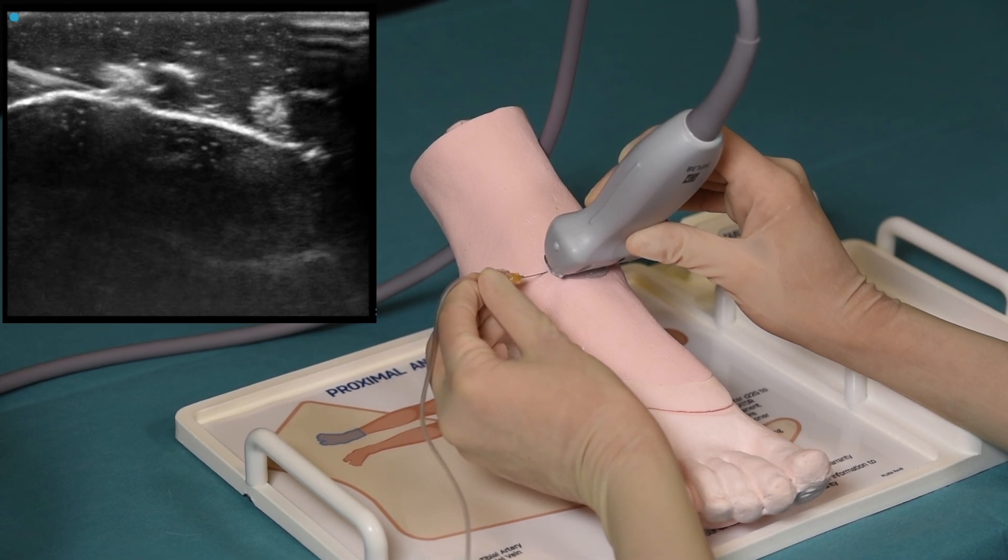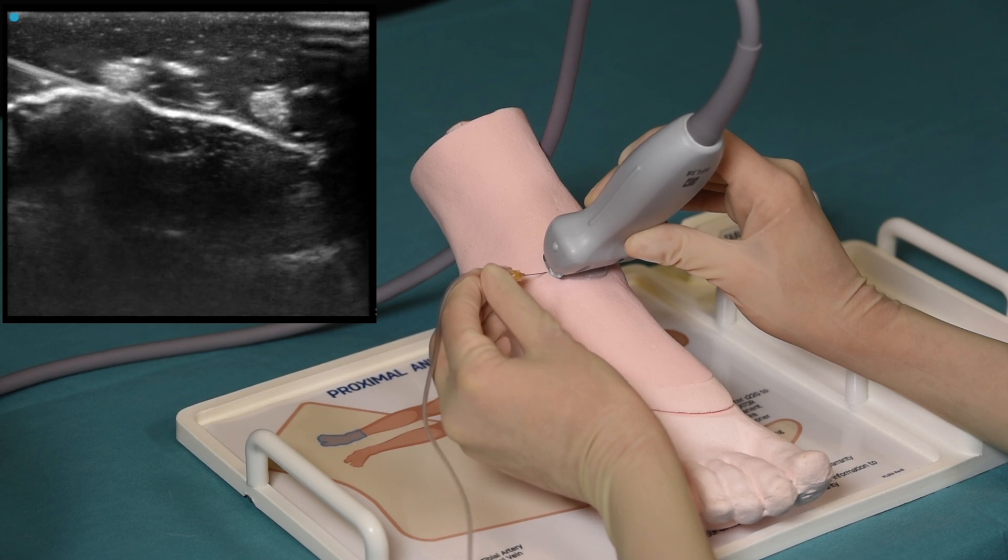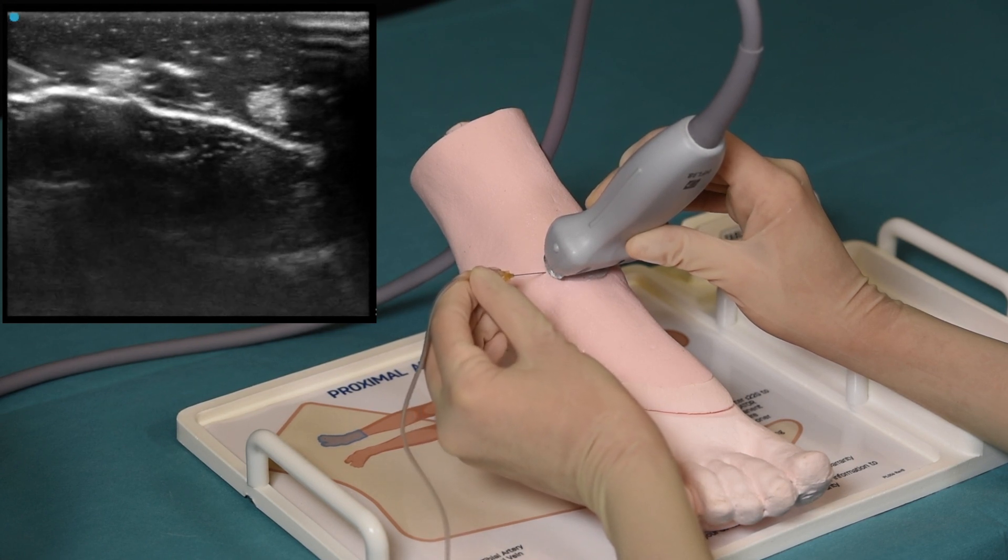The information on how to practice the performance of these nerve blocks is provided in the instructions for use, which are included in the packaging of the ankle block simulator.